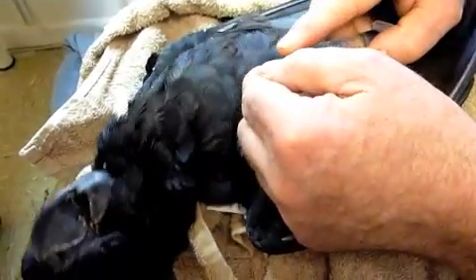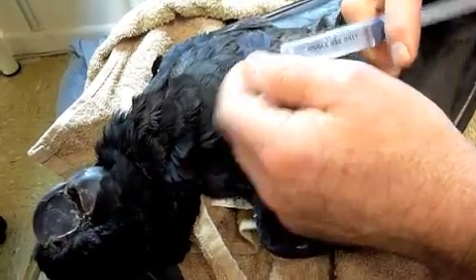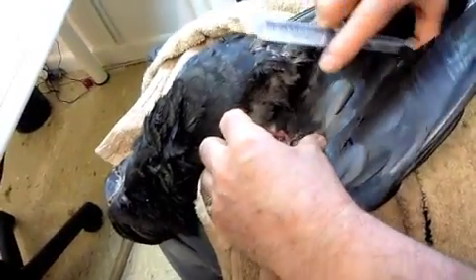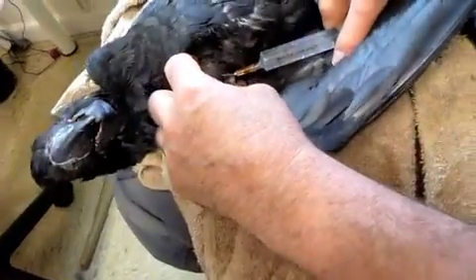I have to bend that needle a bit more. Steady mate, make sure that's patent and that's working. I have to get this between his feathers somehow — that's down at the right angle. Steady mate.